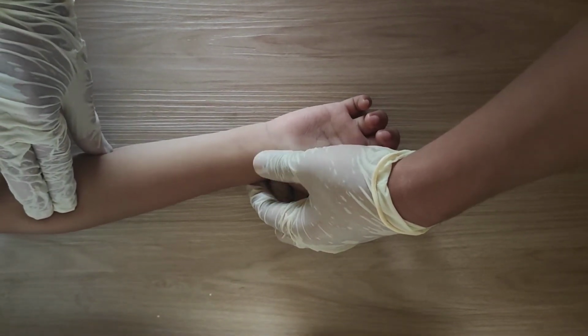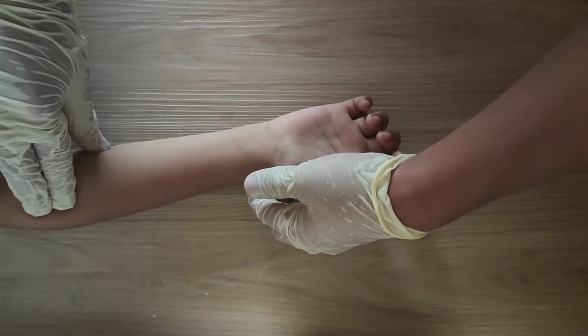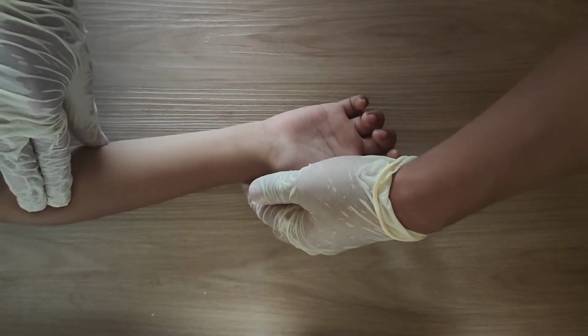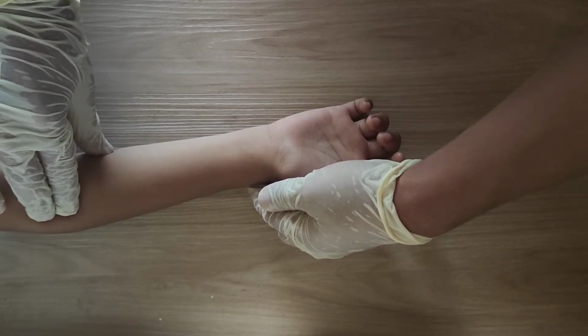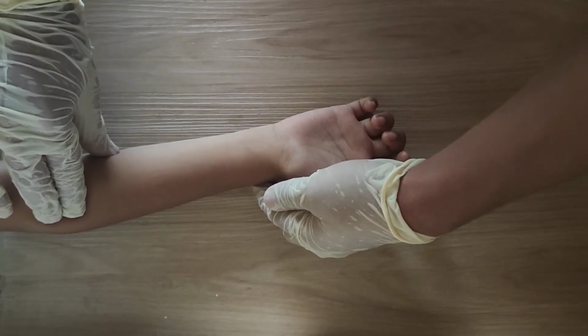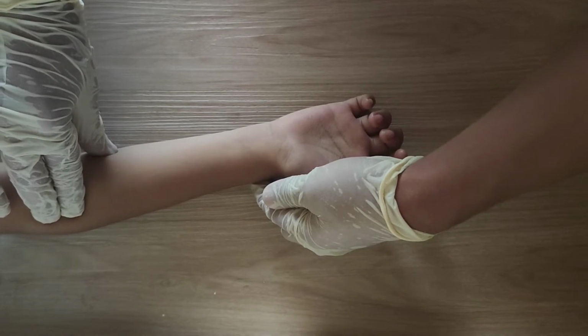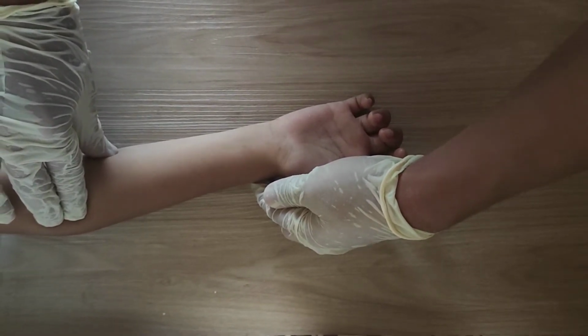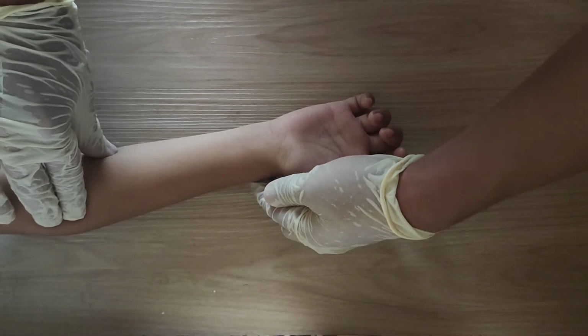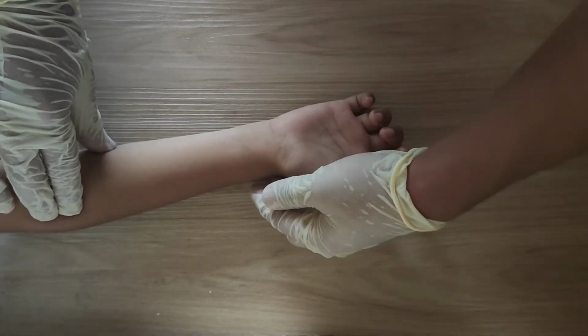Next is position the patient. Use a semi-recumbent position. Elevate and dorsiflex the patient's wrist slightly using a small pillow. Dorsiflexion of the wrist moves the artery closer to the skin surface, making the artery easier to palpate. Next, rotate the patient's hand until the pulse is palpable.